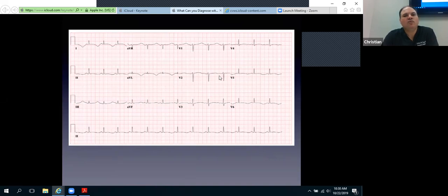So what you're better off doing is trying to find the best example of the QT interval, and that's the lead that you then study and compare to, right? So once I go there, I'm just about on the next one. That's way more than half that interval. That's the way to do it: find the more extreme example within the leads. And this goes back to why it's important to have multiple leads, why having 12 leads is diagnostic, and why having 5 leads and 3 leads isn't. Just as simple as that.